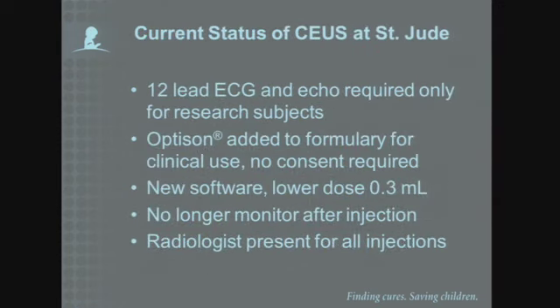So currently at our institution, we continue to require 12-lead EKGs and echocardiography, but only for our research subjects. And this is because there's no direct clinical benefit from undergoing these research contrast ultrasound examinations to these patients, and therefore we set the bar a little bit higher for these safety requirements.